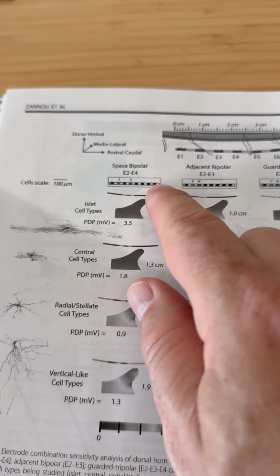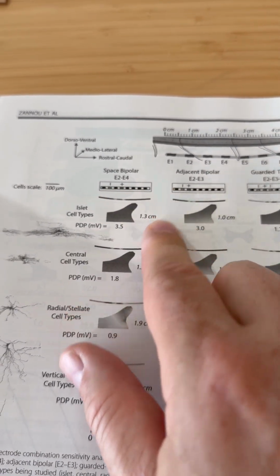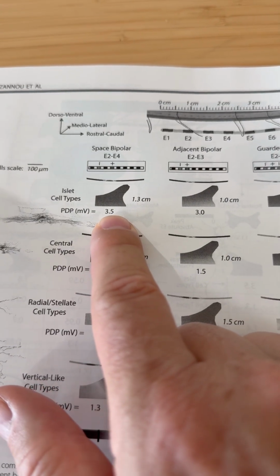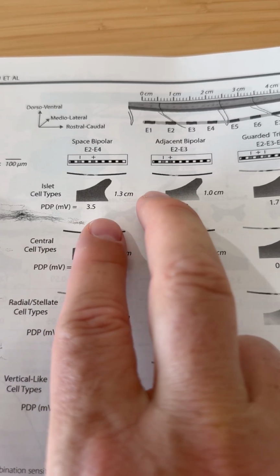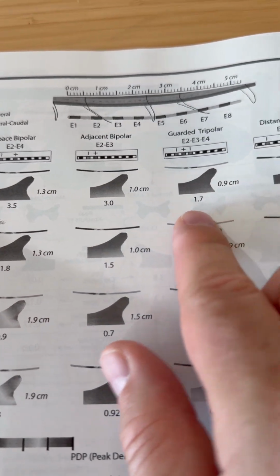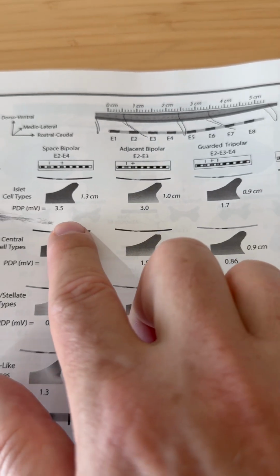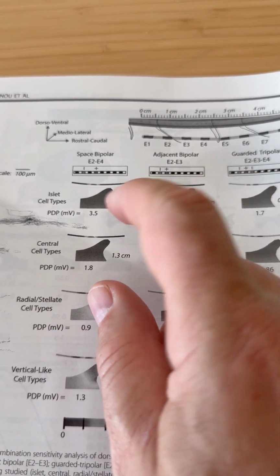And so what we found is, starting again with that spaced bipolar where there's one gap in between the electrodes, there's that 3.5 millivolt value. As you move the energized electrodes closer together, you will produce less polarization, and also less for a tripolar montage. And so there is a moderate penalty for moving the electrodes closer together.